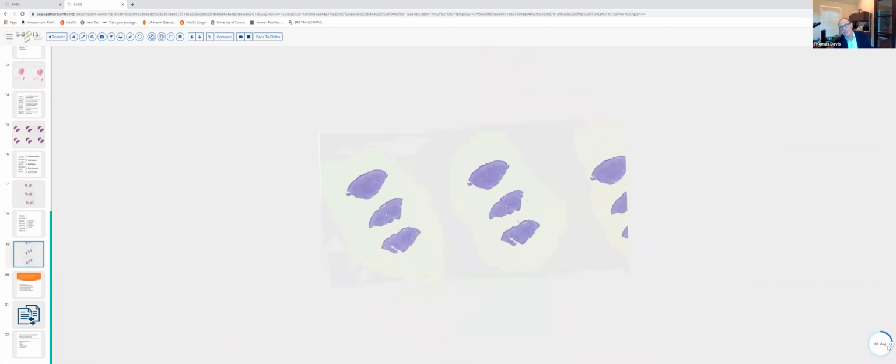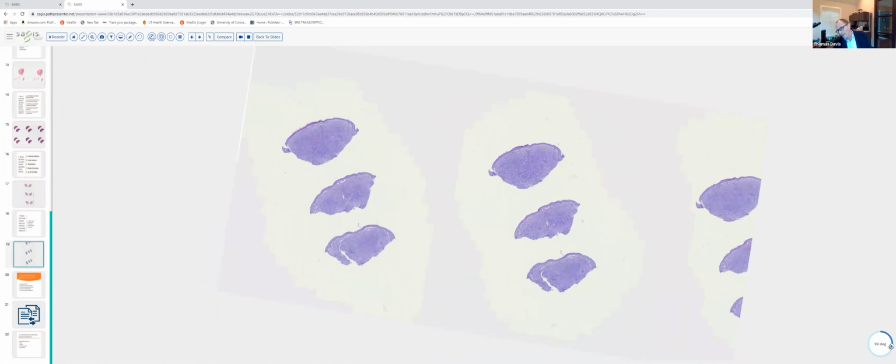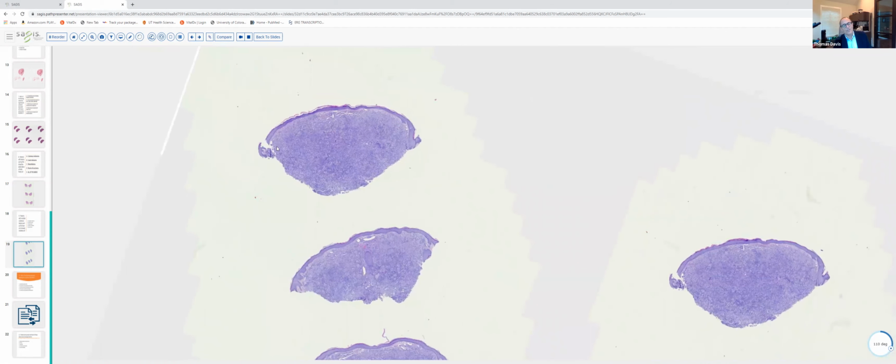Okay, we'll go ahead and move on to slide 10. And the last couple of cases are kind of cousins, closely related non-Langerhans cell histiocytic conditions. And in slide 10, we have a trisected punch biopsy here. This slide's a little on the blue side. The one slide that we looked at was a little on the red side, the BAP1 inactivated melanocytic tumor. We can see that the epidermis here is kind of thinned and that this infiltrate is partially sampled.